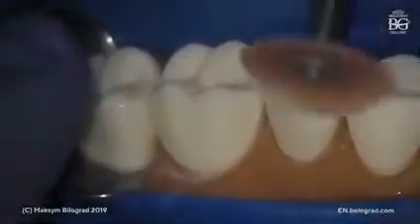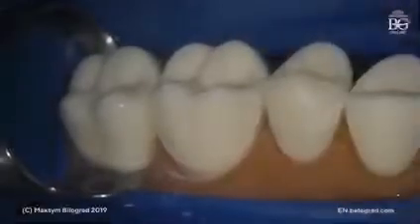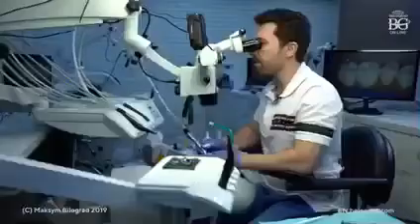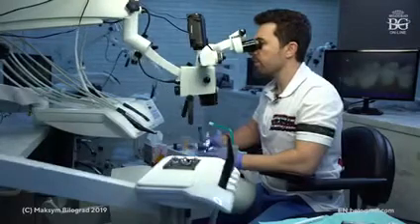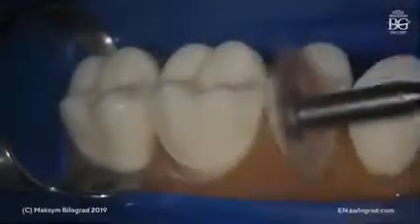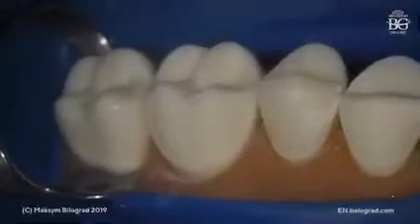We can make it really smooth. Also, if your cusp area is too wavy or rough, you can make it more straight with the disc. Okay, but afterwards you would have to refine the finish line. Okay, but we will do it later on.